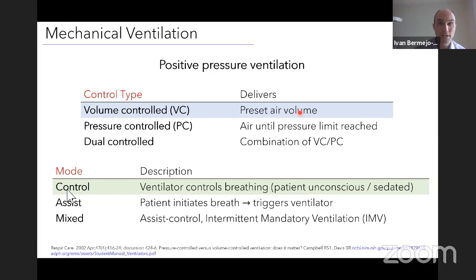So mechanical ventilation that I will describe today in these open source emergency ventilators is mainly based on positive pressure ventilation. This is trying to push air into the patient lungs, which is the most common nowadays, as far as I understand. And even within this type, the most common by far among the different open source designs is volume control.